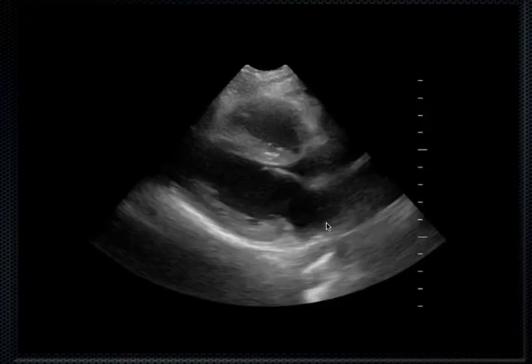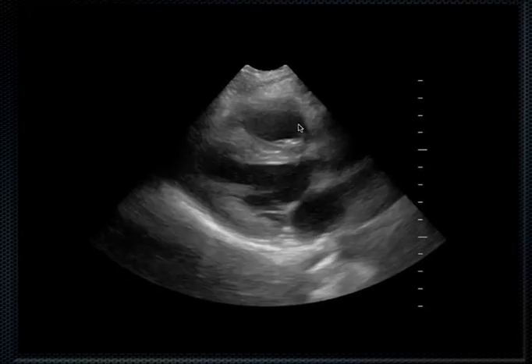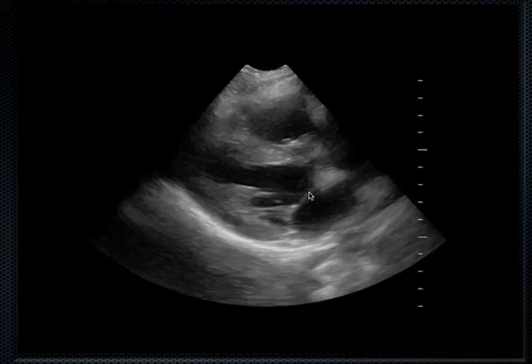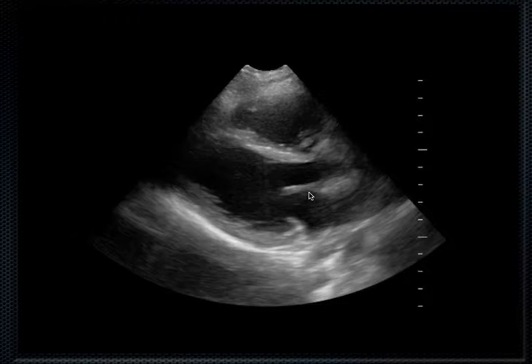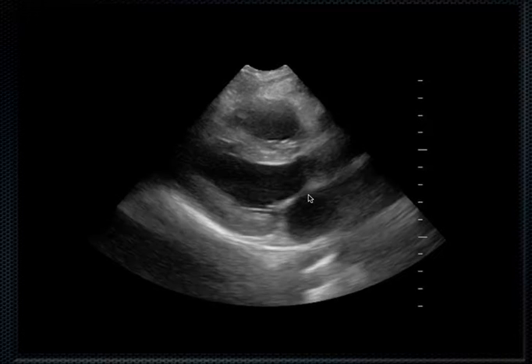And in real life, what we see on ultrasound is this. This is the left atrium, left ventricle, aortic outflow tract, right ventricle. Here's the septum. And we notice how that anterior septal leaflet of the mitral valve, I froze it for a second, is right here. Now watch as it goes through its range of motion. Okay, so here is systole. So the heart's going to squeeze its blood right out the aorta, and as it does so, the mitral valve is closed. Now if I move along here, you'll see the mitral valve will open during diastole.